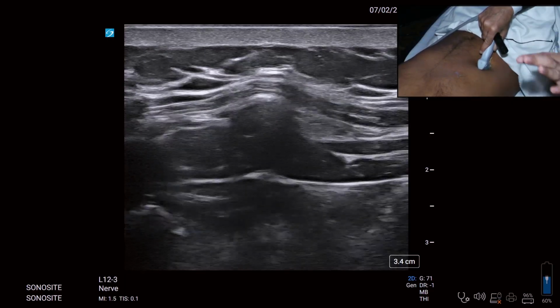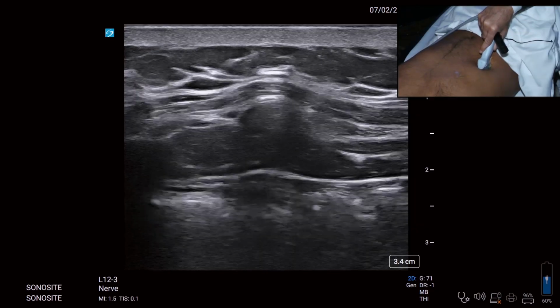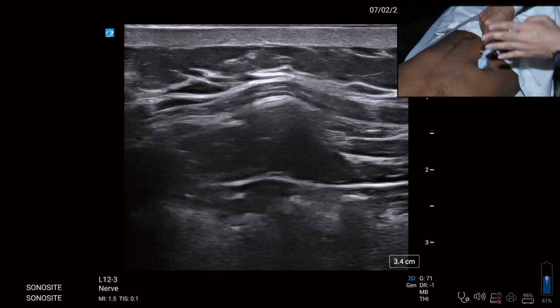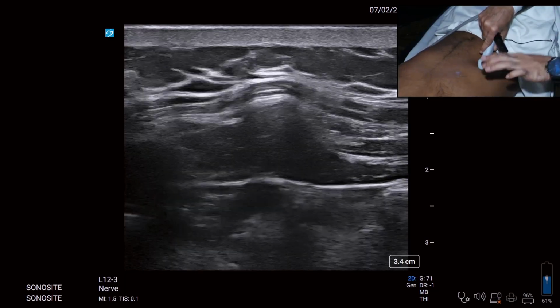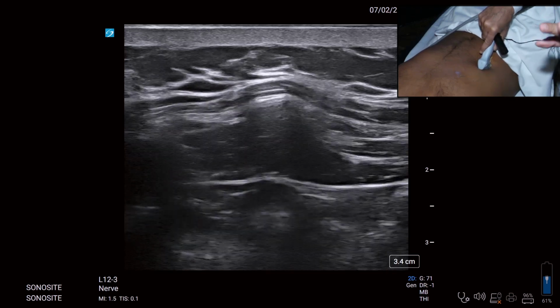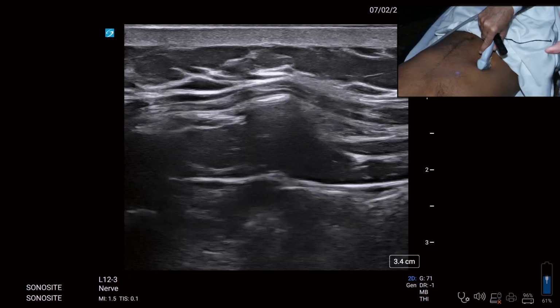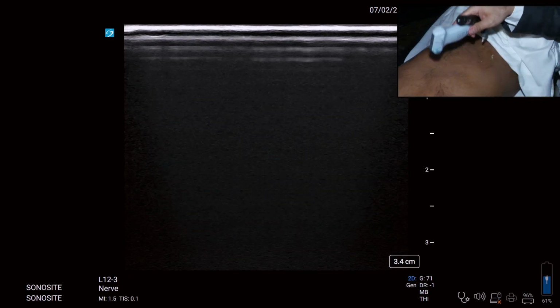I prefer EOI block. The reason being, it can be done in the post-op period also, because my dressings are all placed inferior to the costal margin, and I am doing it at this place. This is the costal margin. So that's the beauty of EOI block, my dear friends, and it's a volume block, 25 to 30 ml of the drug which is given. So this completes our discussion on the abdominal as well as thoracic blocks.